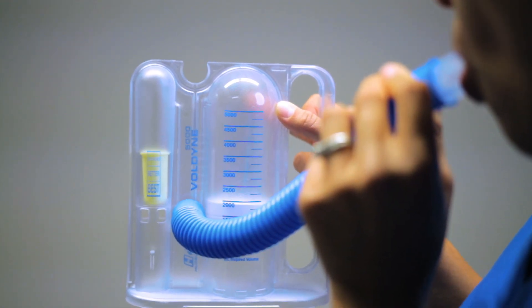The goal of using an incentive spirometer is to make sure the ball stays in the middle of the chamber when you breathe in.